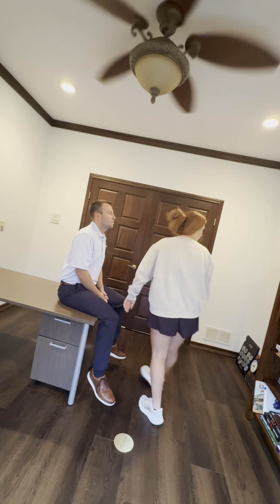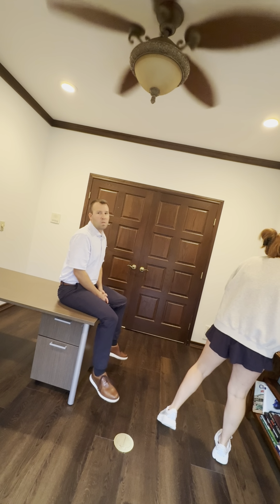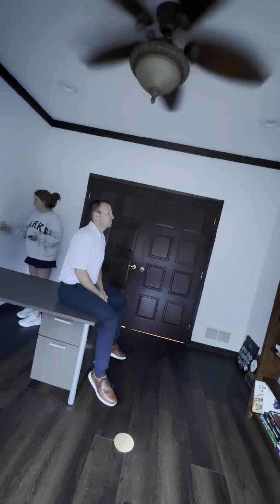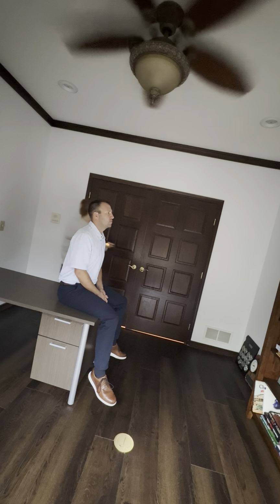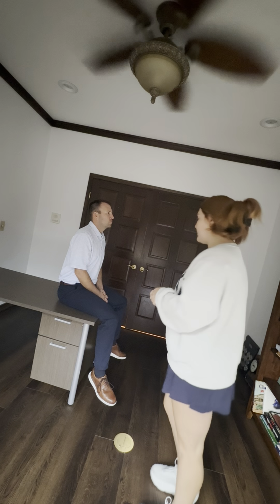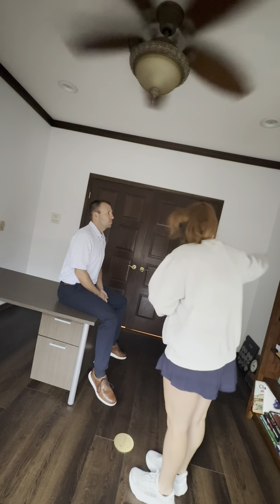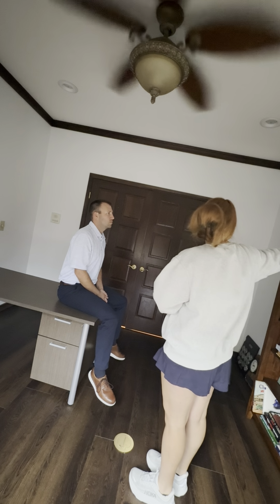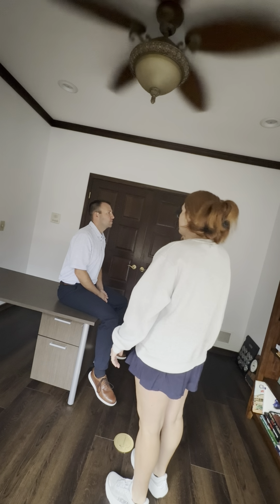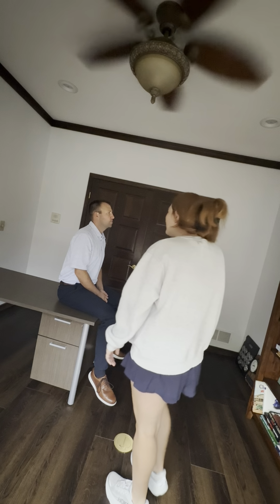Perfect. So there was no abnormal movement under your eye muscles there. Everything was good. And then this next one, which is the last one, we're going to look closer at the back of your eyes, also known as a fundoscopic exam. For the right eye, I'm going to stand at a 15-degree angle, and if you could just pick a spot on the wall or in this cabinet, just go ahead and look directly at that plant the whole time for me. I'm going to come in from like a 20-degree angle using my right eye and look for your red reflex. Then we'll follow it in.